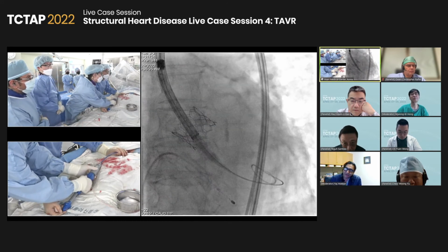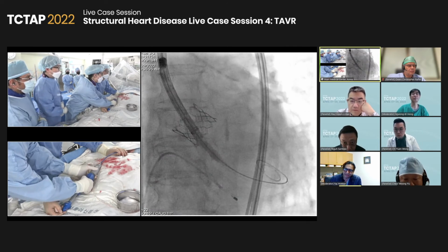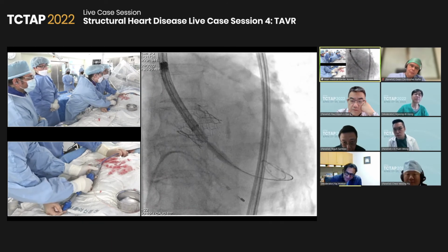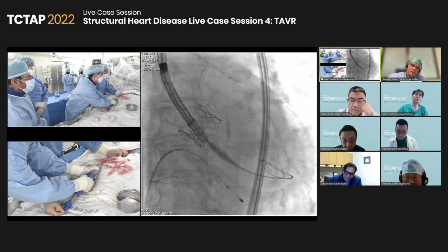Yeah, I would try not to be higher because you want to have your coronary access. Release. Slowly. Slightly lower. But I think this is good. Yeah, that looks good. 120, right?